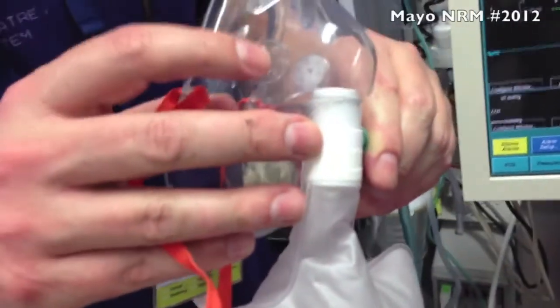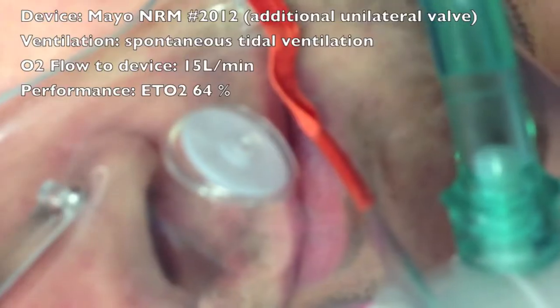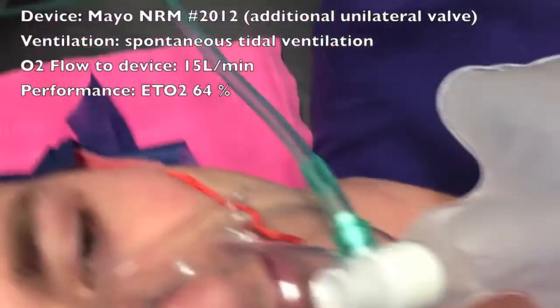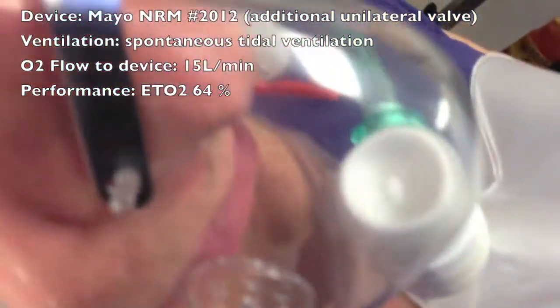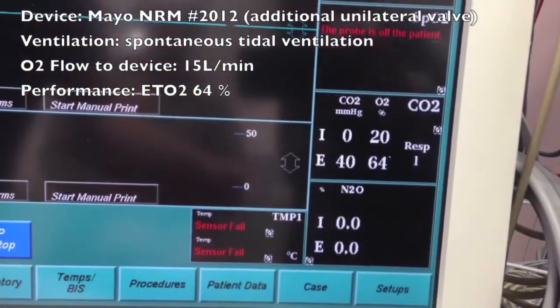The Mayo non-rebreather mask number 2012 features an additional valve on one of the ventilation ports to limit entrainment of room air during inspiration. After a 3-minute period of breathing, this mask produces end-tidal oxygen concentrations only slightly higher than that of a standard non-rebreather mask.